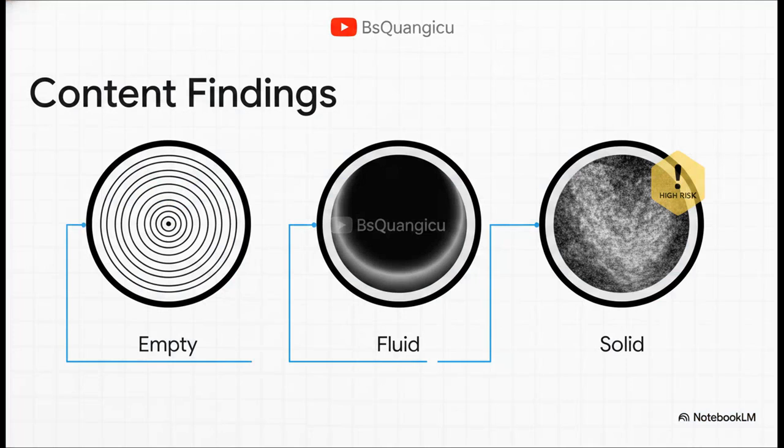And this brilliantly illustrates the 3 distinct sonographic patterns you're going to see. If the stomach is empty, the antrum is contracted, giving you this very clear target or bullseye pattern. If there's fluid, that target gets disrupted and turns uniformly hypoechoic or anechoic. Basically, it looks dark. But if they've recently eaten solid food, you get this frosted glass or ground glass look. It's this messy, heterogeneous mix of food, fluid, and air. And listen, the second you see that frosted glass appearance, stop. You're done. The patient is instantly a high aspiration risk, no matter the volume.